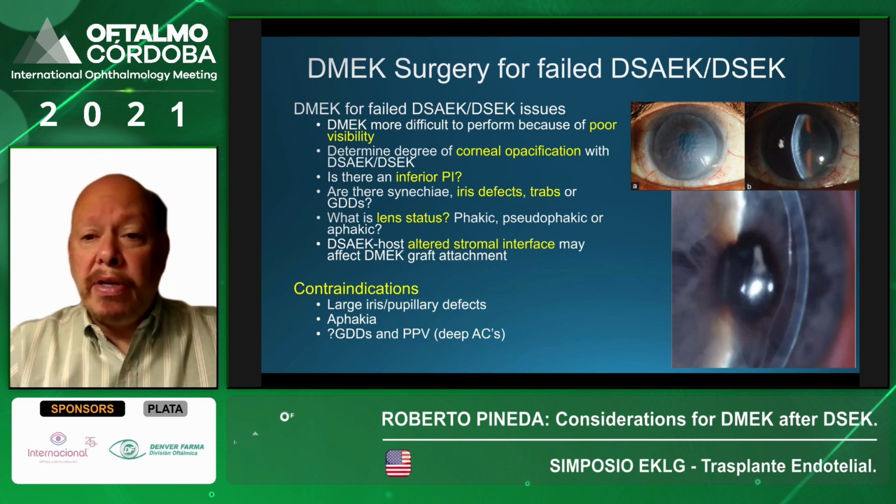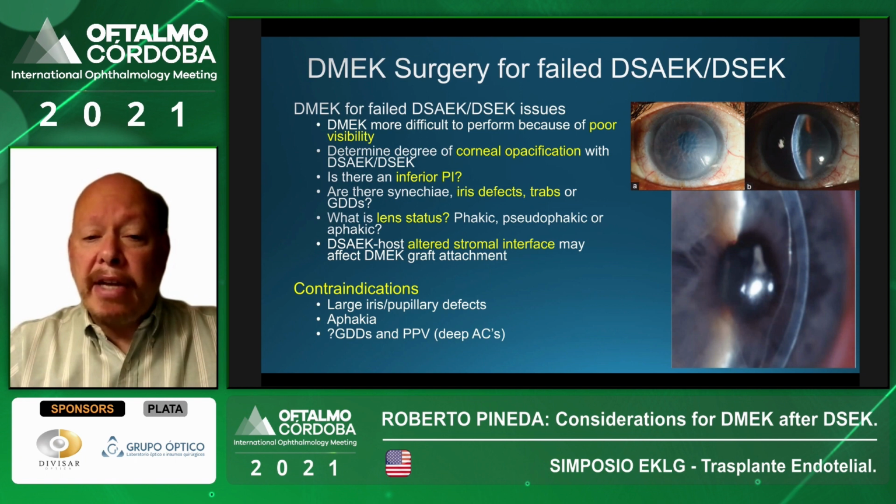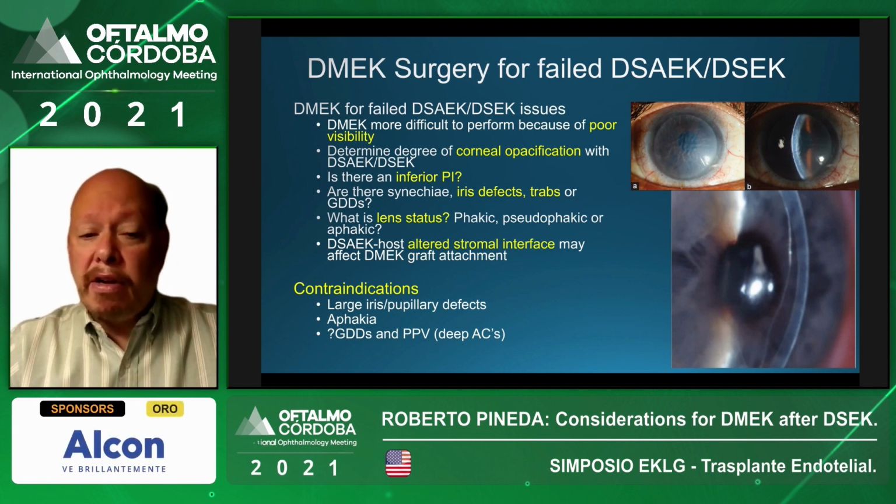And we heard about the importance of stripping for DMEK versus DSAEK from Dr. Praveen. Obviously, patients that have large iris defects or aphakia or have these glaucoma drainage devices, this may be relative contraindications to performing DMEK in these cases.